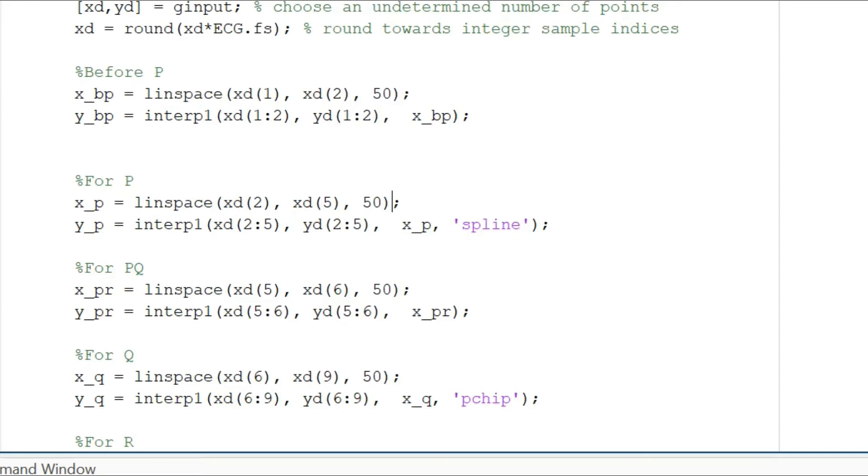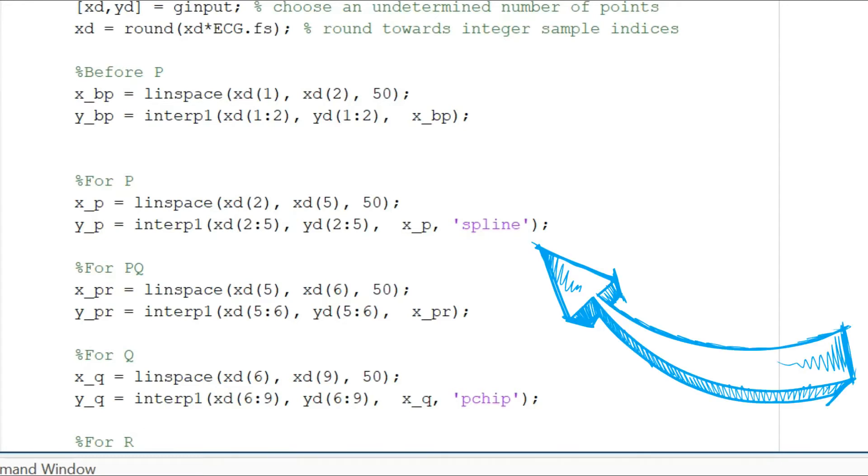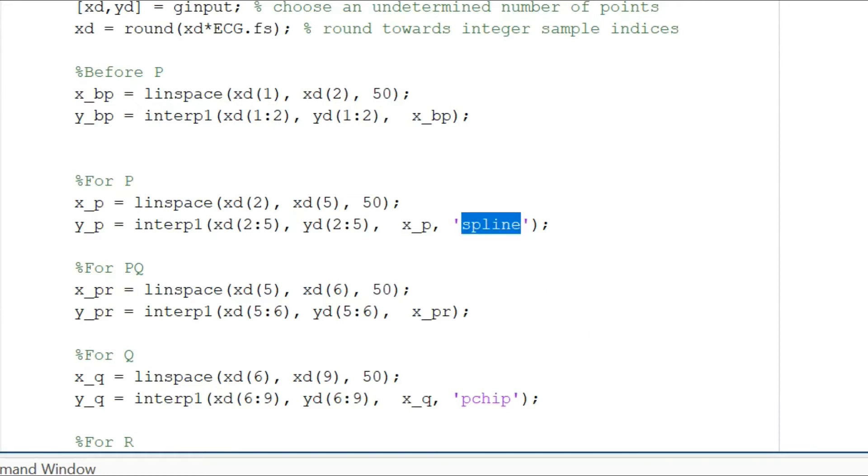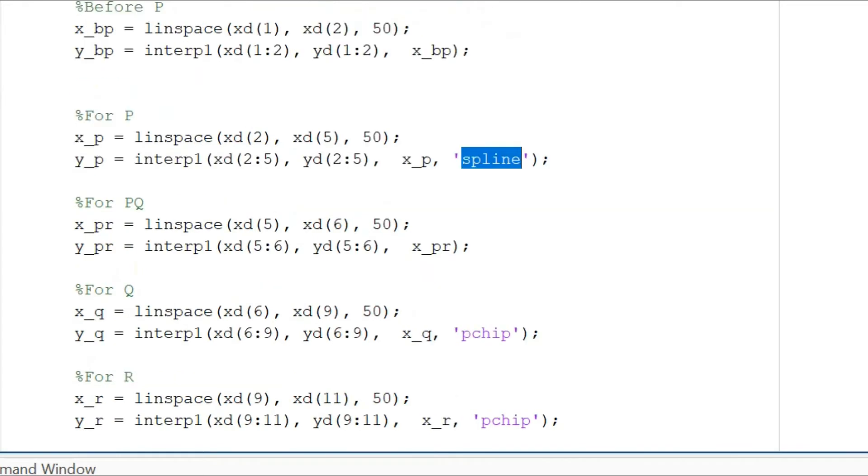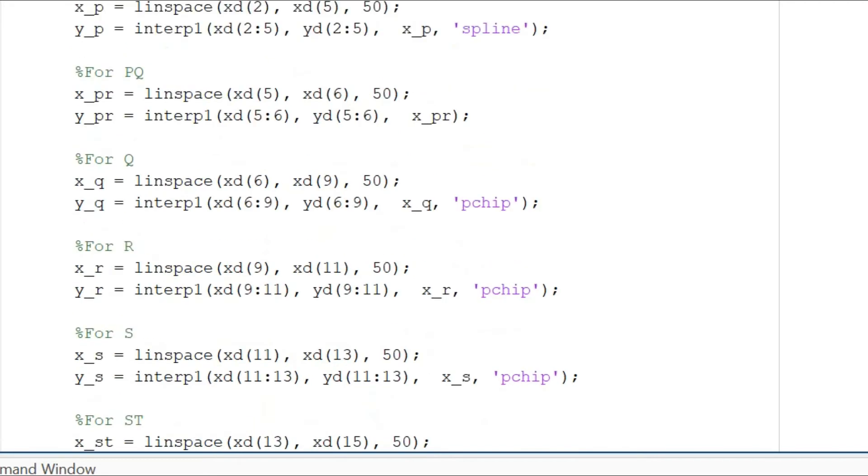For the P curve we are doing a similar fashion but we are also adding a function called spline. Spline represents that round curve that we had indicated earlier.